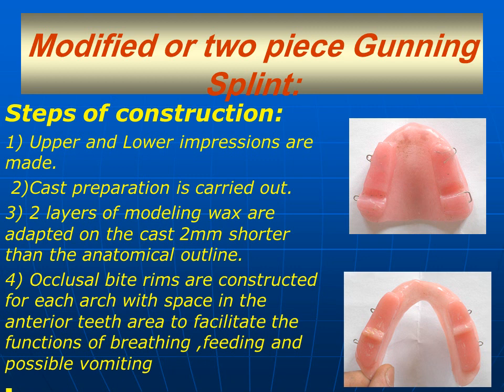بمعنى، أنا هعمله كله من الواكس شبه الريكورد بيس، ولكن الانتيريور بارت is removed، يعني posterior يمين وشمال في الابر واللور، ومن قدام مفيش واكس. بعد كده هنحوله كله into acrylic resin.